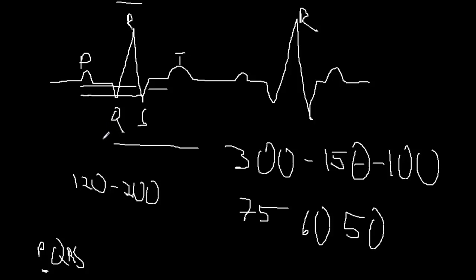That's in contrast to second-degree heart block type 2, which is an impairment of the His-Purkinje system. In that sense, the signal is getting from the SA node to the AV node, and then there's a problem below the AV node. You just get a drop beat and there's no change in the PR interval. So your PR interval will be 0.18, 0.18, 0.18, and then you have a drop beat.